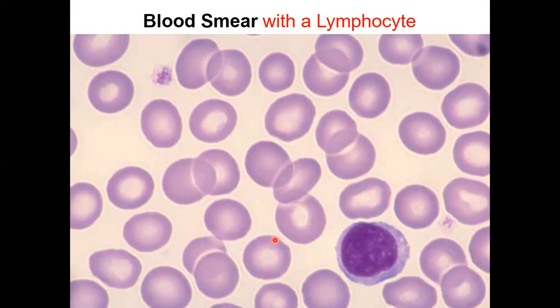So they have a round nucleus that almost covers the entire cytoplasm. So this is a lymphocyte. You see that only a small portion of the cytoplasm is left. So they have a large nucleus and only a small part of cytoplasm is left. Okay, so you need to draw at least 3 or 4 of these and the surrounding red blood cells. So these are red blood cells, and then this is a lymphocyte.